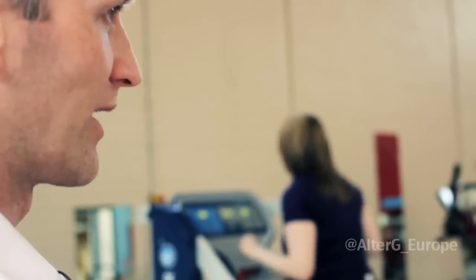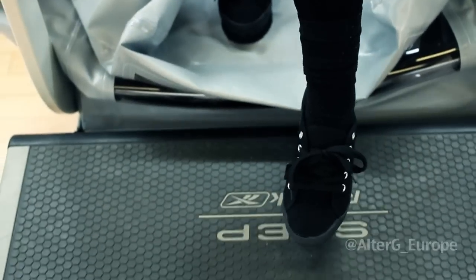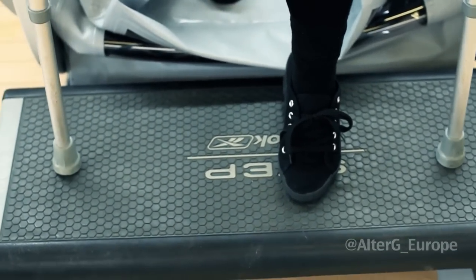The consultants are always very wary about weight bearing with those injuries and you wouldn't encourage patients with intra-articular fractures to push it, but because you can offload the weight in the machine it automatically makes it much more comfortable for them to run. It works both ways — it stops all the immobilisation effects of not being able to do something, but it also stresses the bone enough to stimulate healing a bit better.